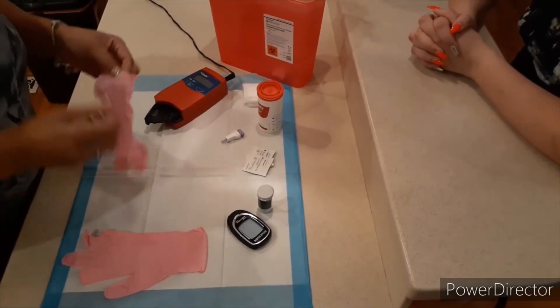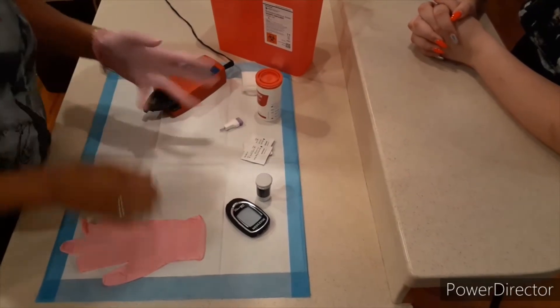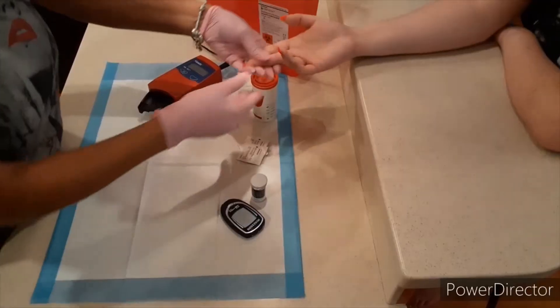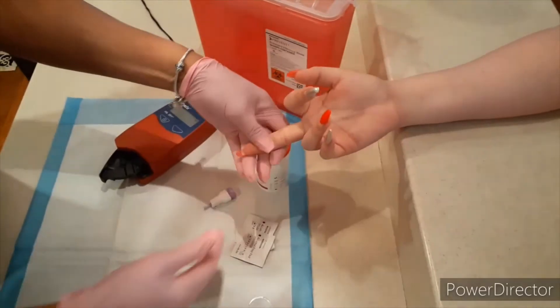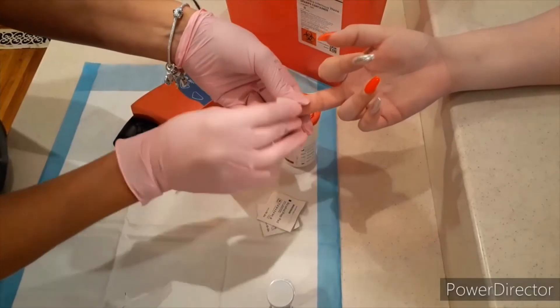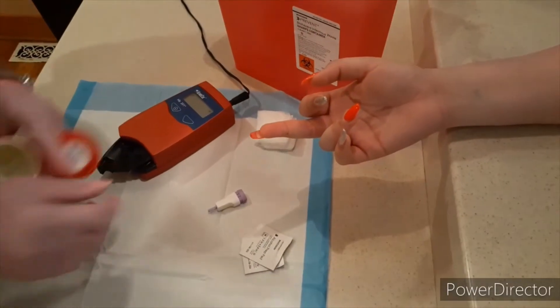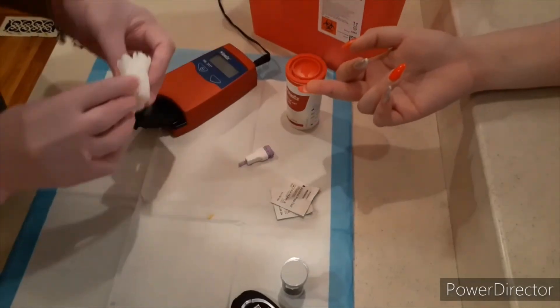After a good hand washing, I'm going to apply our gloves. I'll start with the hemocube machine, which is going to test for hemoglobin. Make sure the patient has clean hands, and we'll just milk their finger a little bit to get the blood up to the tip. I'm going to clean with alcohol and allow that to dry — don't wipe it or blow it or fan it. Get my cuvette ready and some gauze.